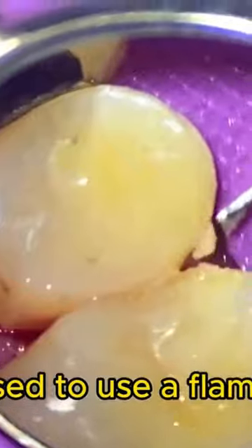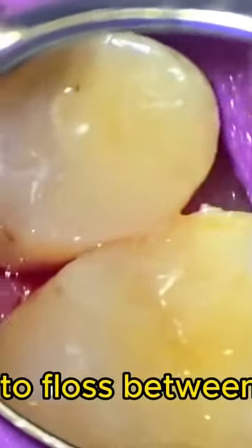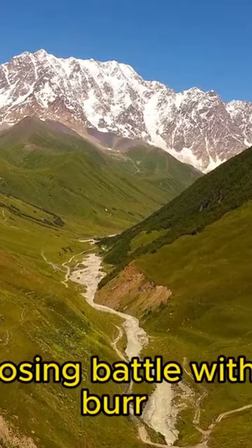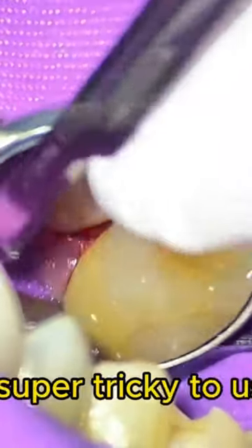For years I used to use a flame finishing burr to try to create this subtle detail, and it helps the patient enable them to floss between their teeth. But I always gouged the restoration and it was a losing battle with that flame burr. And even at slower RPMs, it's super tricky to use.